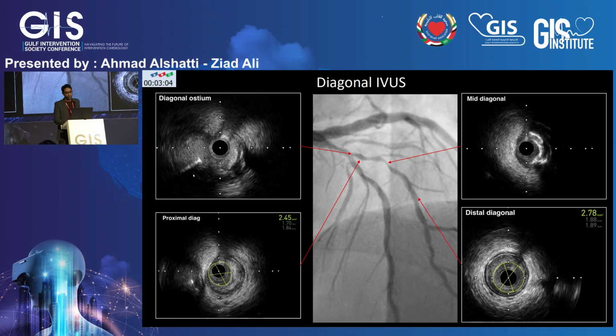So what you're going to look for ideally, we call the green light zone, is a plaque burden less than 30%. The amber light zone is 30 to 50%, and greater than 50% is an area with high risk of dissection and high risk of target vessel failure. Again, as we pull back, what else do we notice?